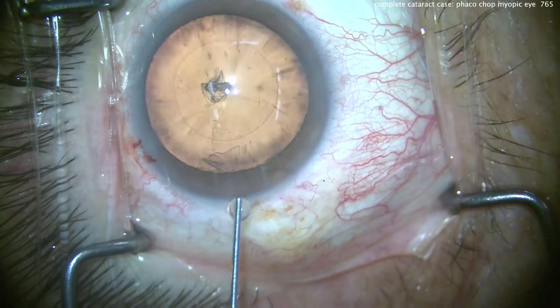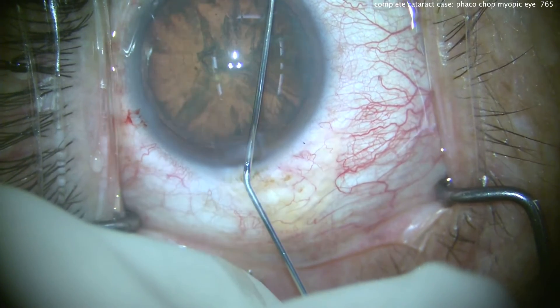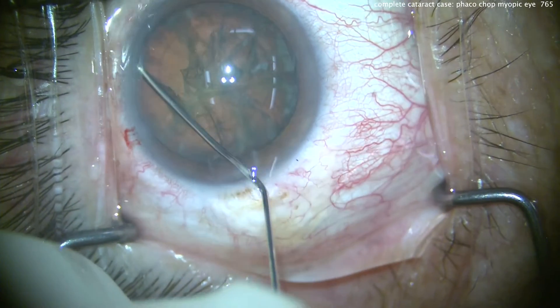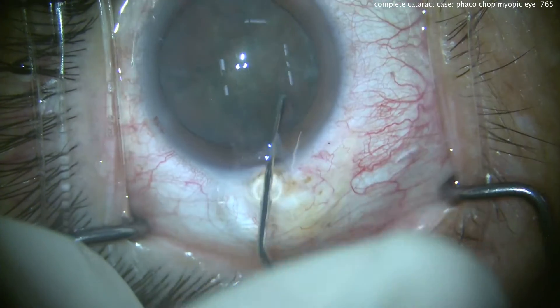Notice the eyelashes are all draped out of the way — that's important too. Balanced salt solution for a hydrodissection. There's a good fluid wave. We try the other direction. Tap the nucleus, see if we can rotate it. That looks pretty good.